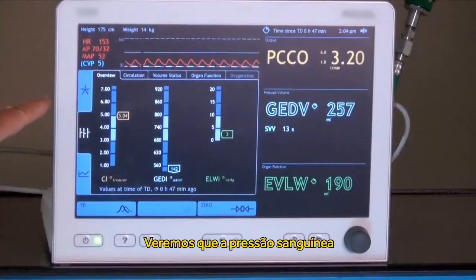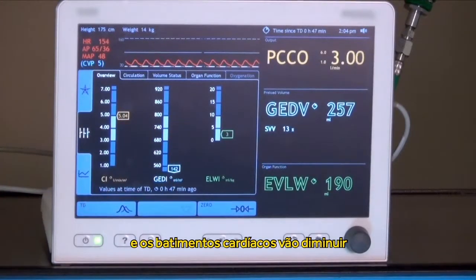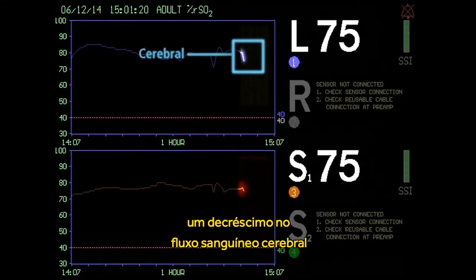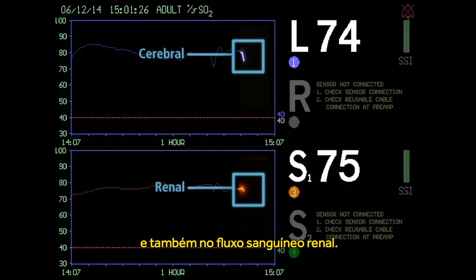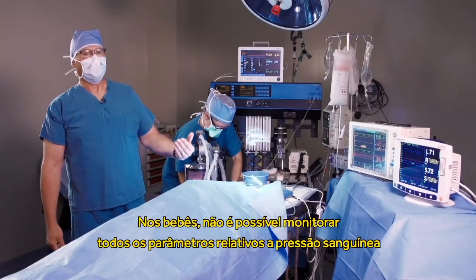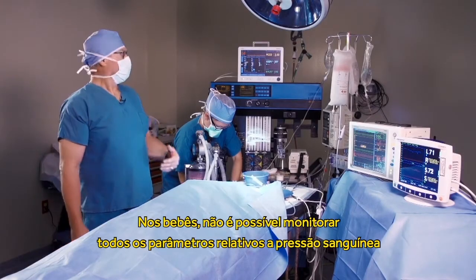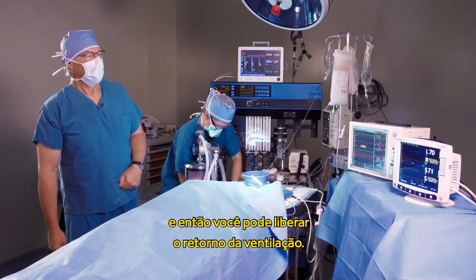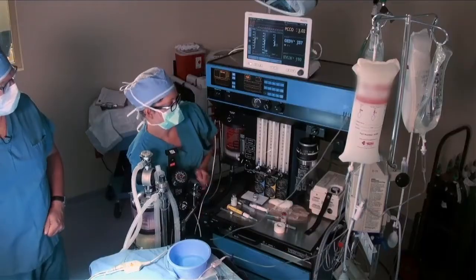Look at the blood pressure and the cardiac output is going down. The INVOS monitor is going to start showing a decrease in cerebral blood flow and also in the renal blood flow. In a baby, you cannot monitor anything but mean blood pressure. So the INVOS is the only one that will tell you whether flow is going down. And you can allow the patient to breathe again.